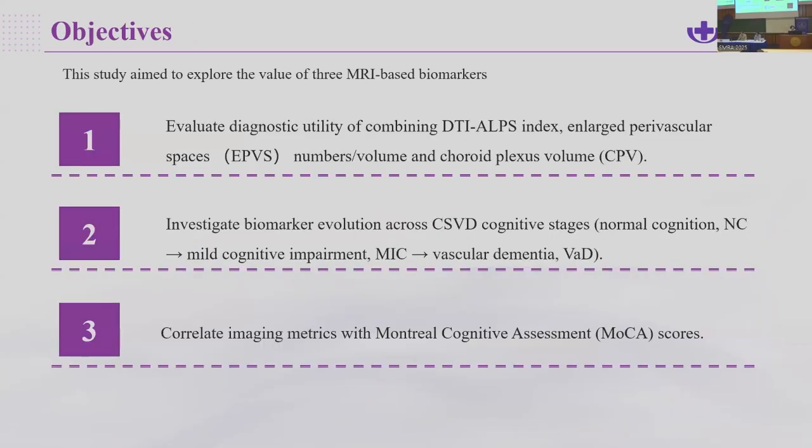This study aims to explore the value of 3 MRI-based biomarkers, the DTI-ALPS index, enlarged perivascular space, and the choroid plexus volume.